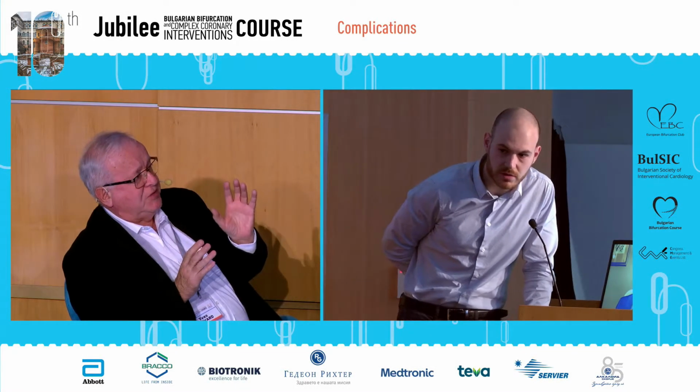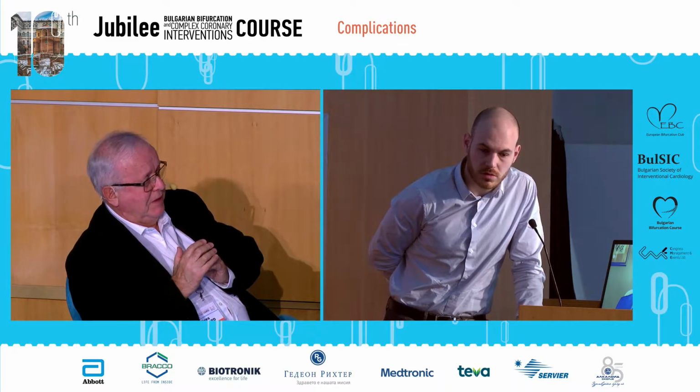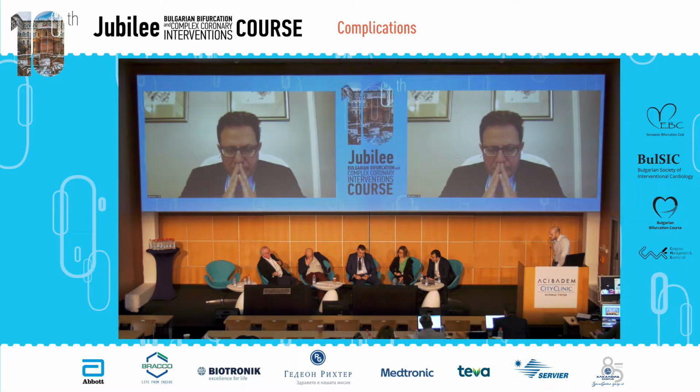What I observed with this dissection was that it probably stopped just before the bifurcation. No, it was clear that this was an iatrogenic dissection, and we decided to fix the entry of the dissection. Yeah, this is something we always say, but this dissection is not open. Yes.